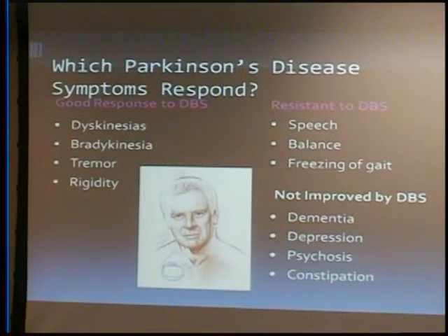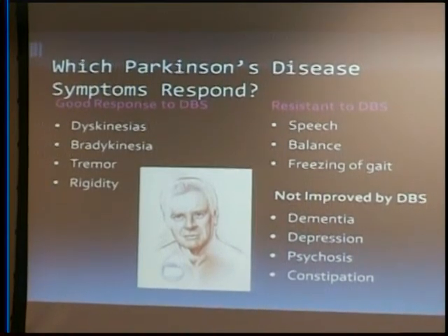I've had a couple of patients as well, when we look specifically at this question of balance, who have been falling, sometimes upwards of 10, 20 times a day prior to surgery. They may be falling during their off time. They may be falling because they're very dyskinetic. And I've had patients after surgery, by improving their on time, reducing their dyskinesia, that fall rate really reduces significantly. So again, the balance and freezing gait is a kind of wait and see, unfortunately. In some patients I've seen really good benefit, and in others they say, it's about the same.